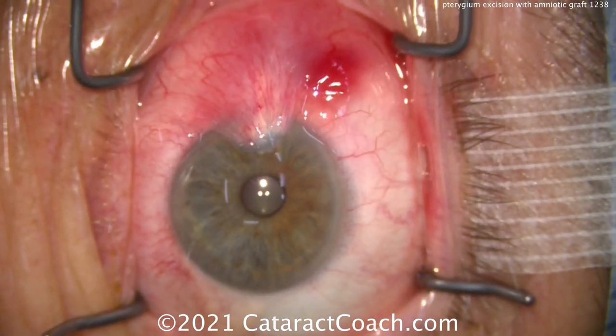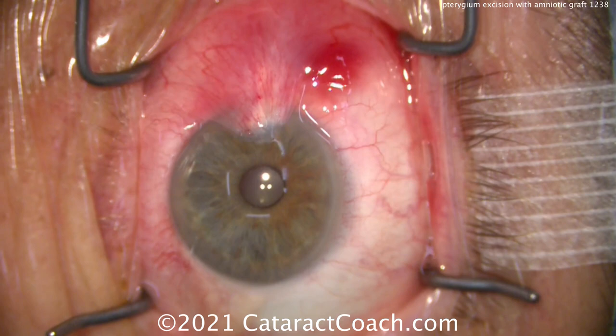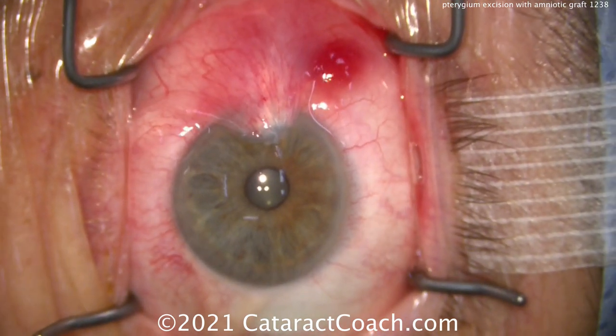Now we did the prep, now we come back, and that helps get us some good vasoconstriction. So now you can see the extent of the pterygium.